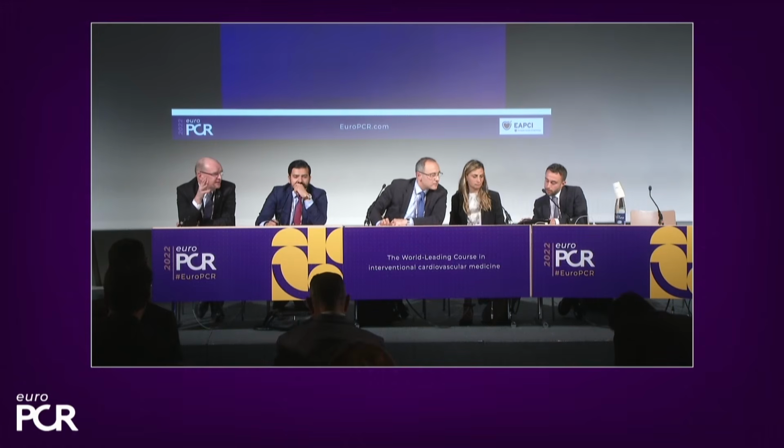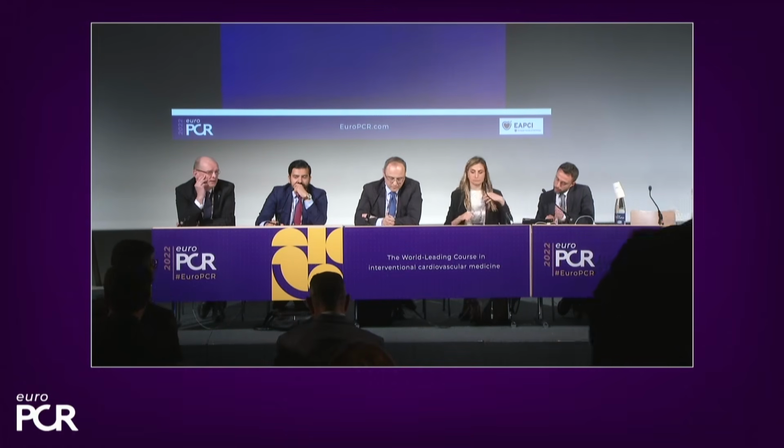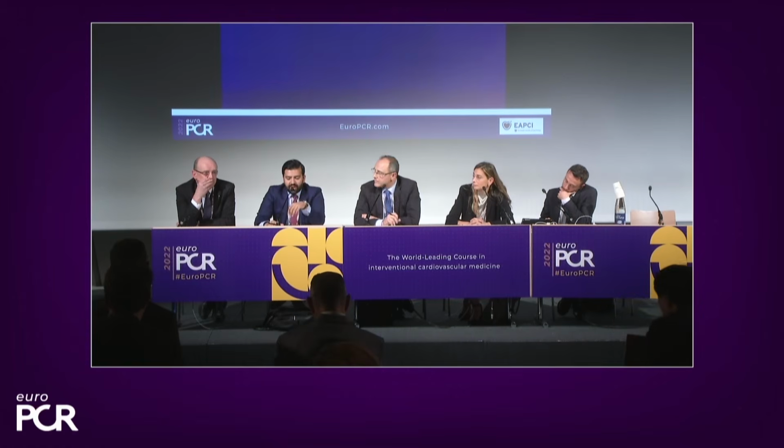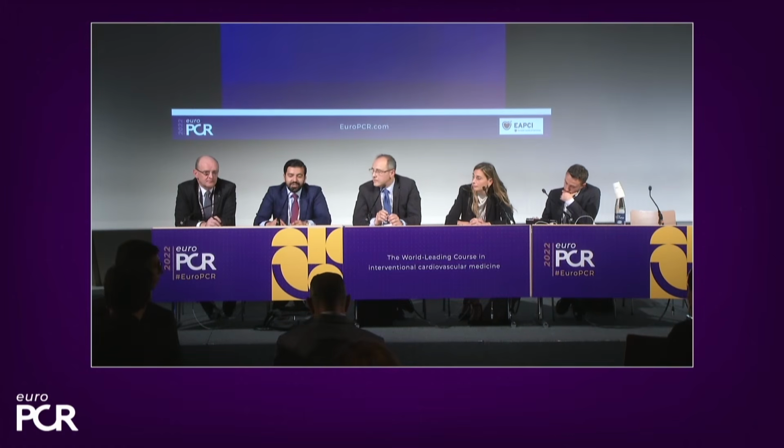But generally, these days, I think we would think that's too small, and we should be aiming for 10, if we can, in the proximal LAD and beyond in the left main. That's been borne out by the EXCEL IVUS sub-study data as well. So you definitely want to go larger. The 5, 6, 7, 8 is just a bare minimum. You want to go as large as humanly possible without, obviously, getting a perforation.